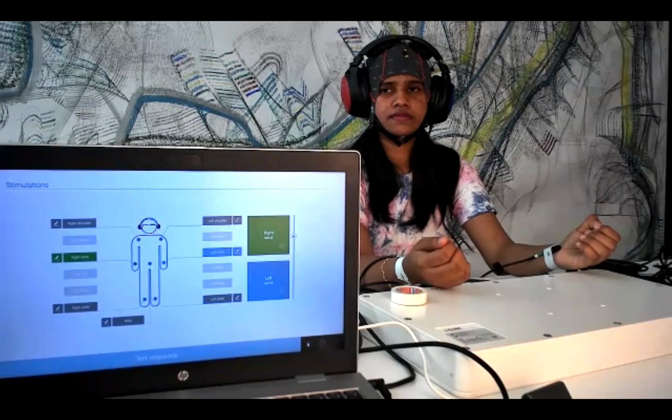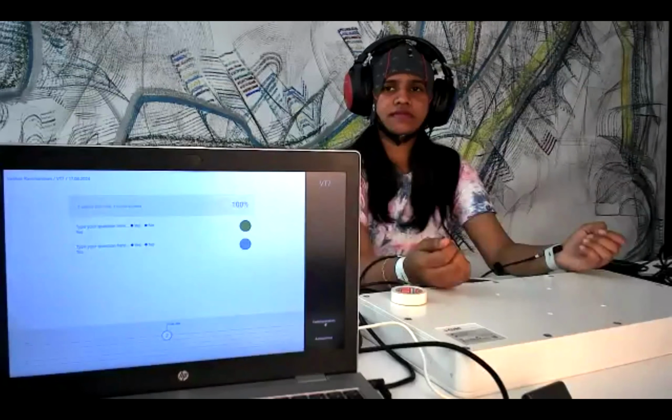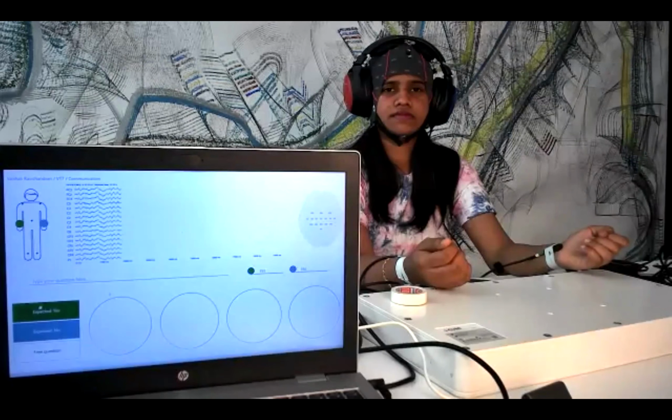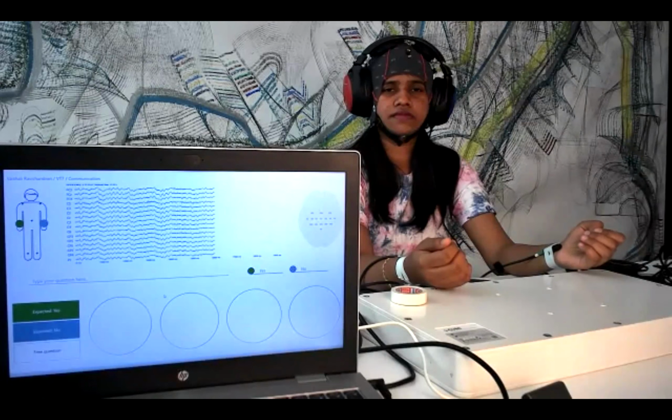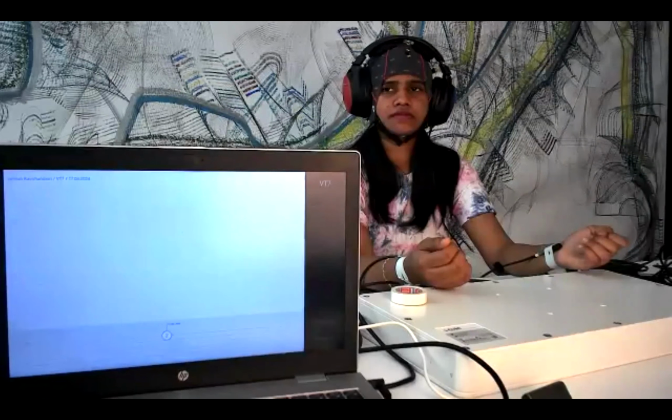And we also have the communication here for the VT3. So it's basically the same setup as the VT2. So you see all this running page here, as I also explained a little bit before. So you can start with the questions with the VT3 also.